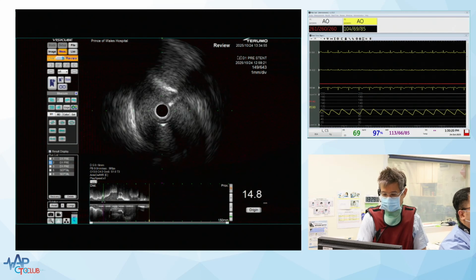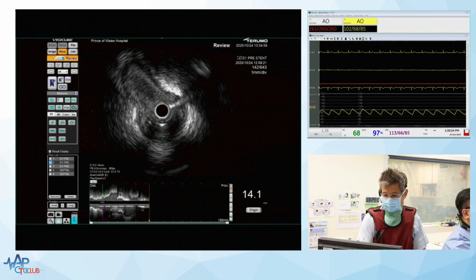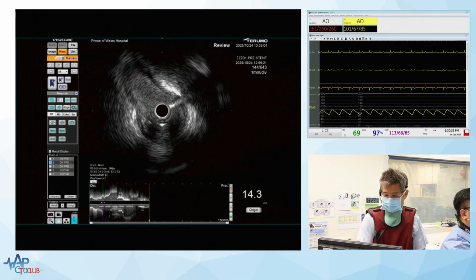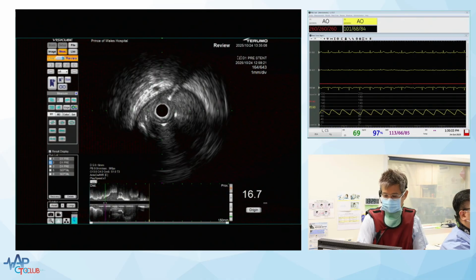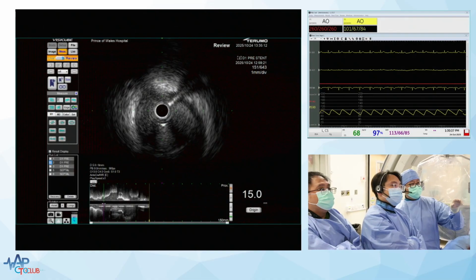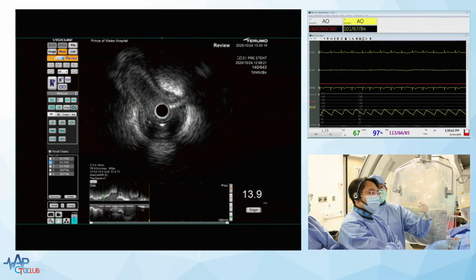Yeah, there's a little branch at the top, and then this at 4 or 5 o'clock seems to have another joining it, but it's not clear. From the wire, you can see that there are 2 wires. So we can tell that the proximal cap is unlikely to branch off from the diagonal side.